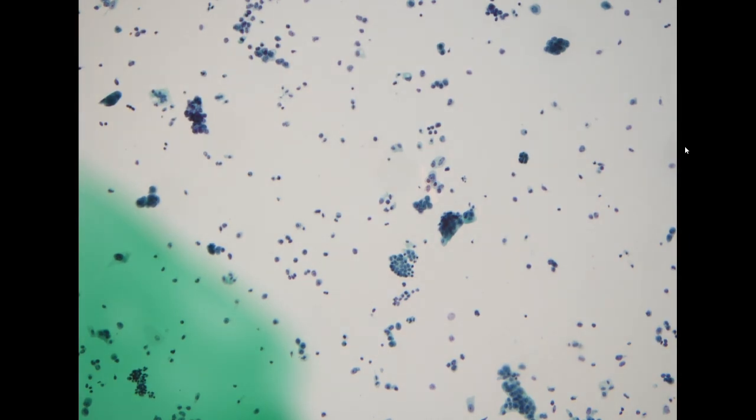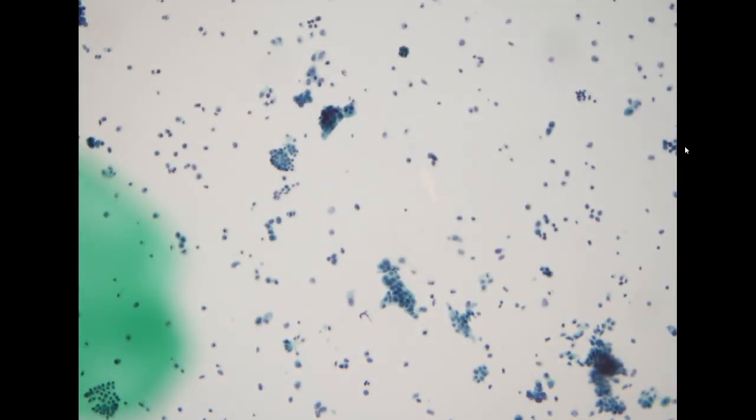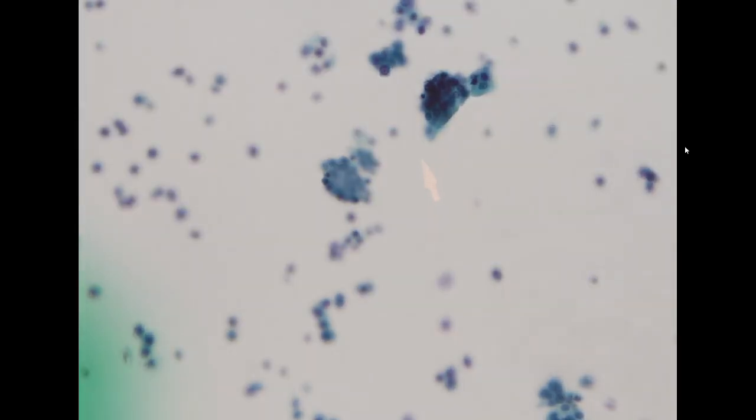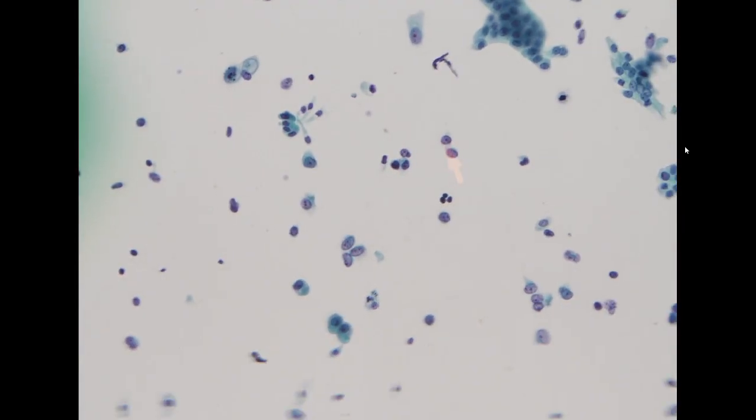Because it is a urinary tract washing cytology, it is common that you can see benign urothelial fragment with a nice umbrella cell at the periphery, at the same time with the high-grade urothelial carcinoma.